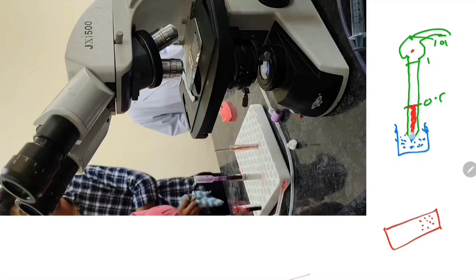So what will happen? You are taking diluting fluid. So how much diluting fluid? To cover it. If you start taking diluting fluid, this diluting fluid actually pushes the 0.5 blood towards the center. So blood will push here. So the 0.5 blood will go in the bulb, and then it will be filled with the diluting fluid, up to this, and this whole bulb will be filled.